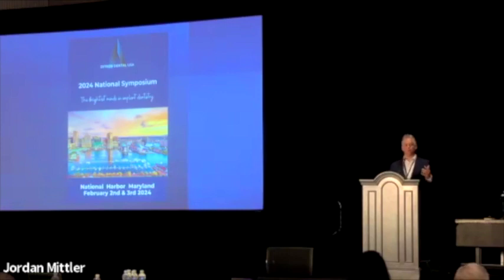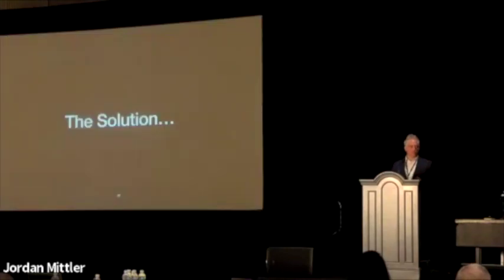Photogrammetry is basically photography, which of course is a 2D image, and it's used as the inputs to create a 3D object. From photographs, there are specific measurements that can be taken, and then those images can be conglomerated, merged, or stitched through software to create a digital 3D image. It's pretty cool technology. It's used, like I said, in map making, in crime scenes, and in shipwrecks. If you've used Google Maps, they use photogrammetry.